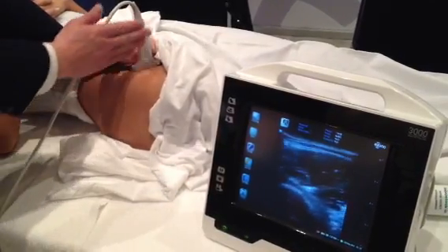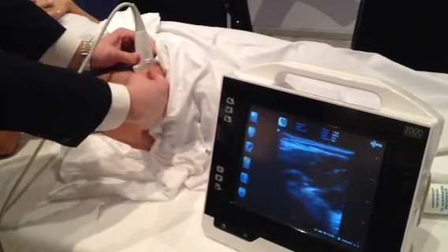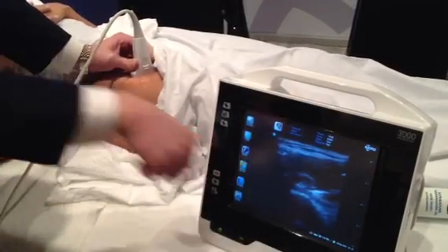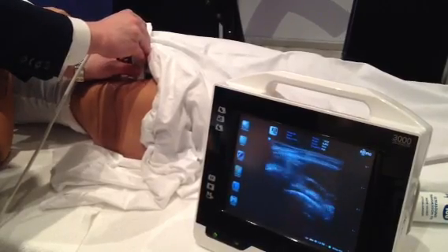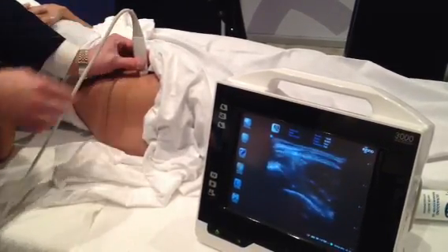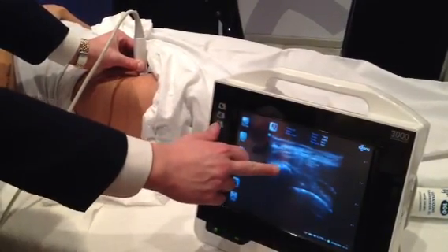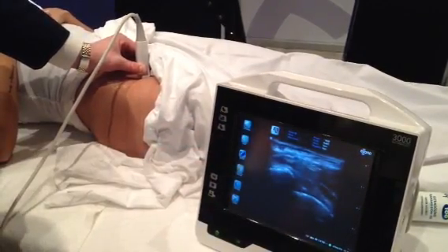Because the transducer is this way and the bone is going long 90 degrees from the transducer, I want to rotate my transducer keeping my eyes on the head, rotating so I'm going long up and down the bone. In my image, this is going to be superior, inferior — I see this bone here, that's your acetabulum.